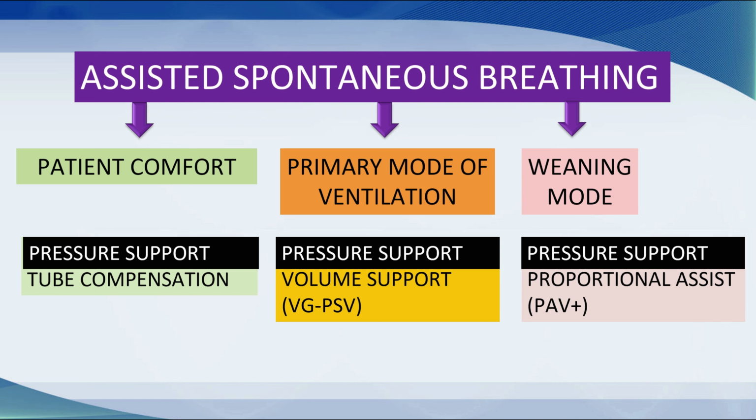But what's useful to notice is that for all of these, pressure support ventilation as a standalone mode works perfectly well. And that's why I'm going to talk specifically about pressure support in these two tutorials, as it's widely used. It's relatively easy to get started with, and a lot of people think they know a lot about pressure support because it's so easy to use initially, but there's a lot of nuance with this mode of ventilation.